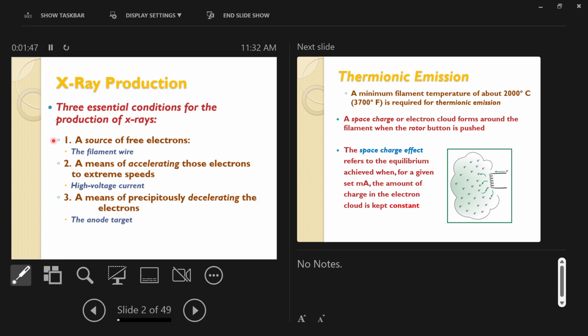Okay? What chapter is the one you're on right now? Chapter 9, the X-ray tube. So yeah, X-rays are a type of light. If you've been with me through physics, you know that light, visible light, X-rays, radio waves, all of that, they come from the movement of electrons. Electrons are the electrically charged particle orbiting around atoms.